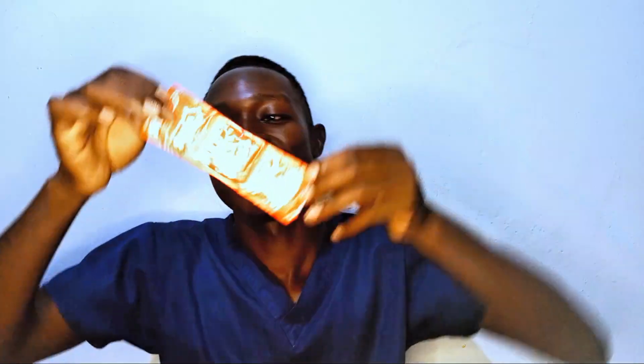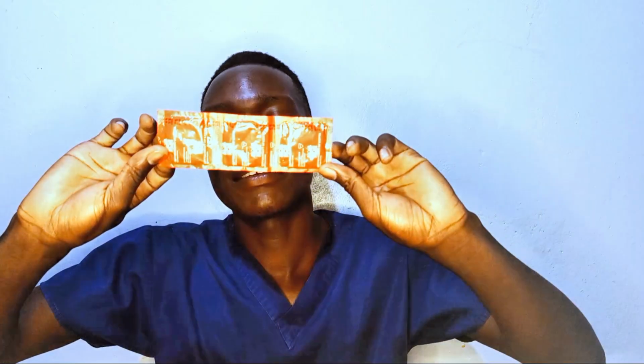I don't have a mannequin, so we have the mannequin which can represent the male genital. I'm not going to use a mannequin because I don't have it, but I'm going to use either this one or this one to represent the male genital organs. I also have this over here. Yes, this is the most common. This one is provided by the government of Kenya as lubricated condoms.